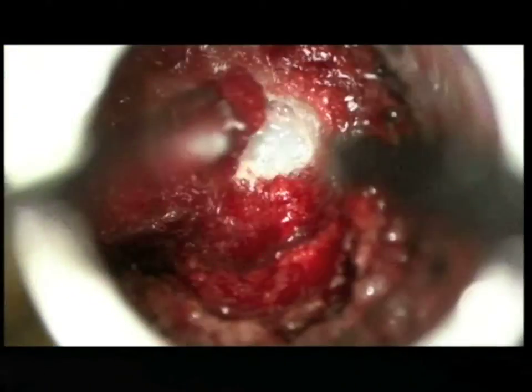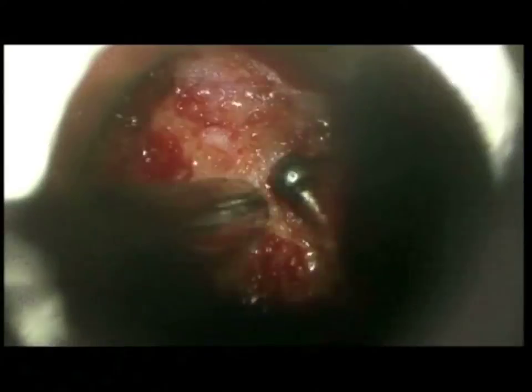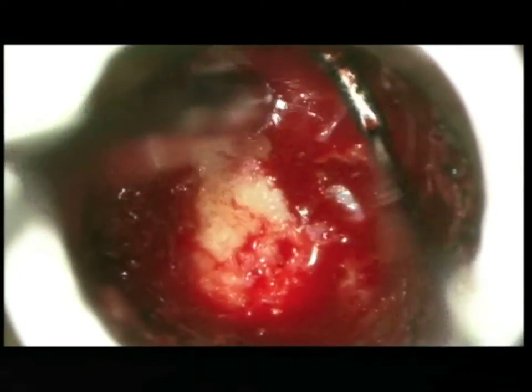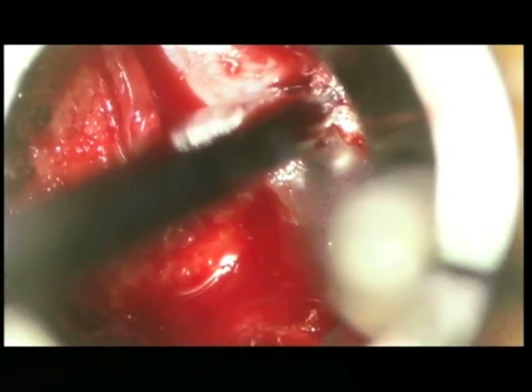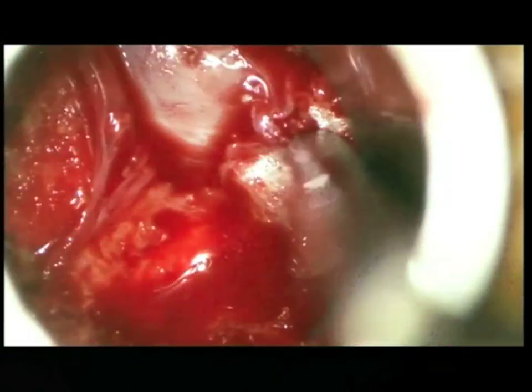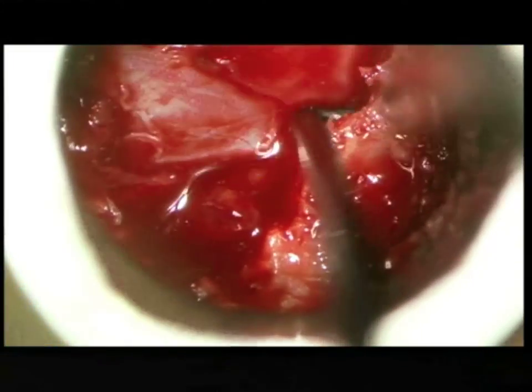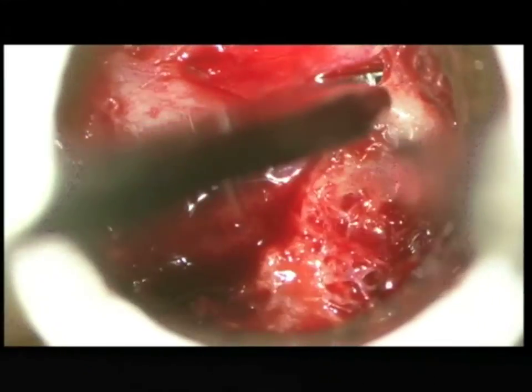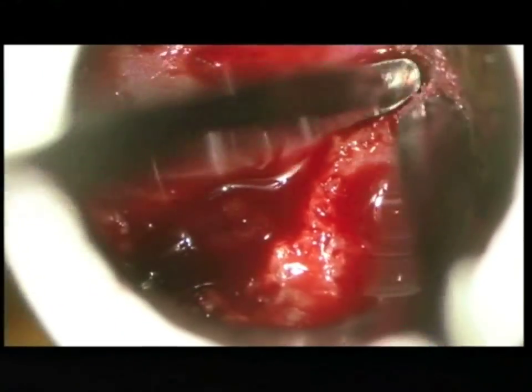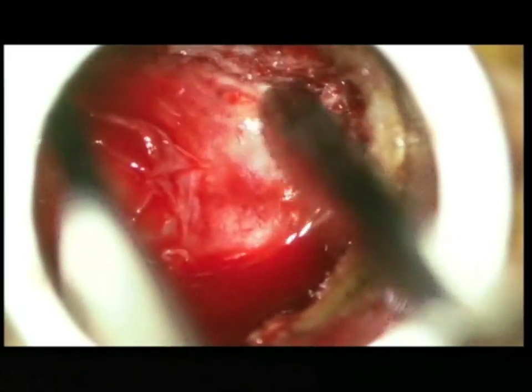The laminectomy is continued rostrally past the insertion of the ligamentum flavum until epidural fat is visualized. The Kerrison rongeur is utilized to resect the ligamentum flavum. This resection is extended until the lateral edge of the thecal sac is visible.